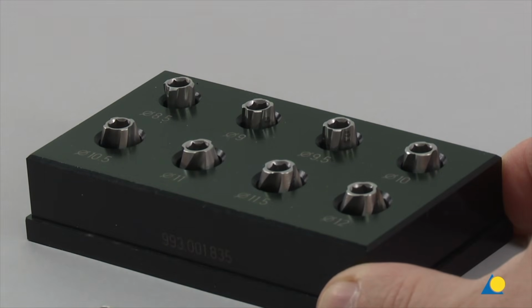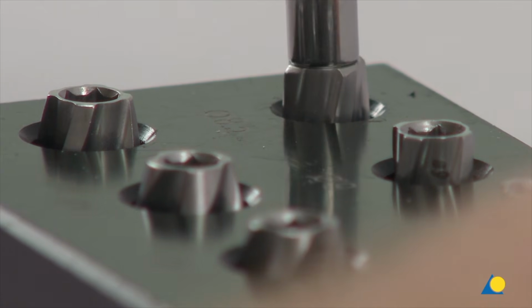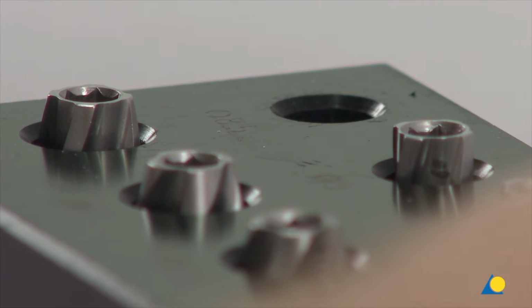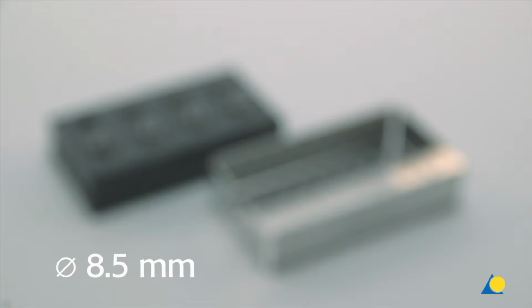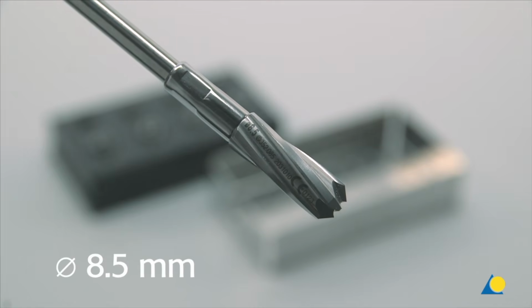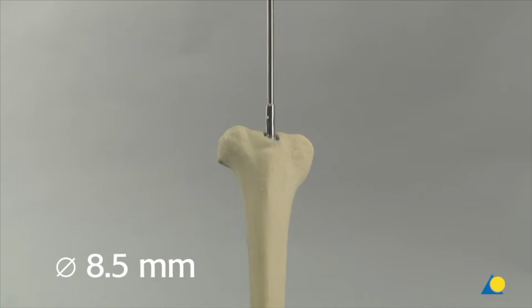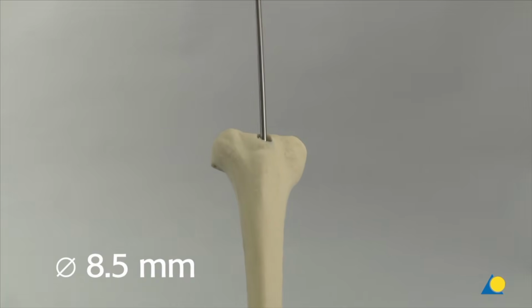To begin reaming, the 8.5 mm diameter reamer head is attached to the flexible shaft by inserting the tip of the shaft into the cannulation of the reamer head in the tray. The 8.5 mm reamer head can be seen to have a cutting tip. The reamer is advanced over the reaming rod with steady, moderate pressure. The reamer should not be forced and is often partially retracted to clear debris from the medullary canal.